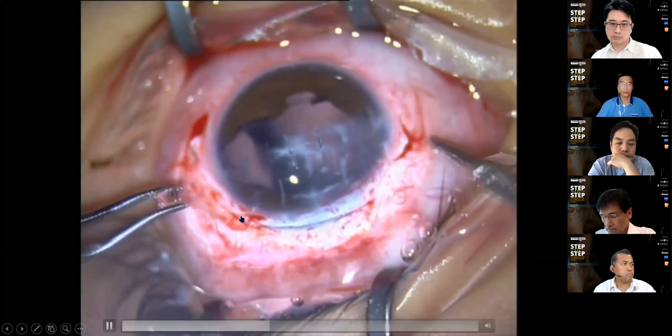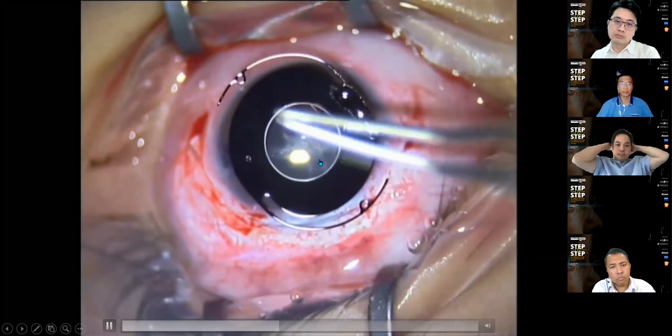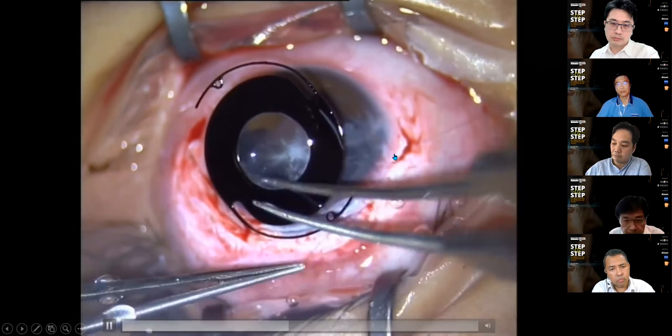Now I prepare for the IOL insertion. In this case, this is the aniridia IOL made of PMMA. The black part will serve as the iris, and this is the optical part. The size of the optic you can choose accordingly. This is tying one of the eyelets with the free end towards the right side of the flap, belonging to the right side of the flap.